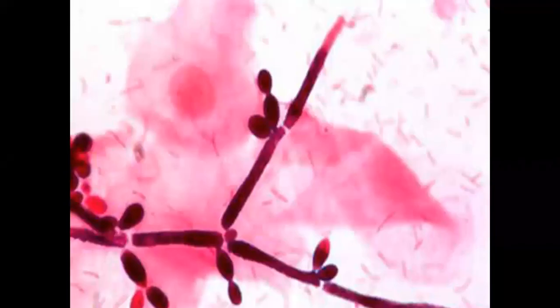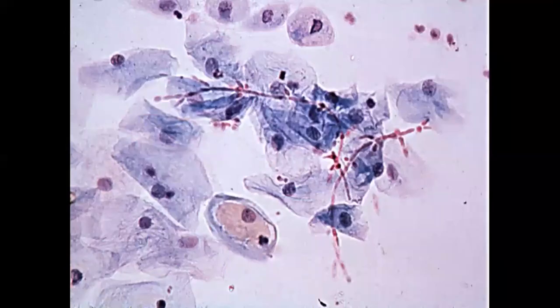cervix, you can see the fungal hyphae and the buds. This is again Candida, but this time this is sputum. You can see cells which are flat epithelial cells, and these are from the buccal cavity. You can see some of the cells on the top of the slides which are a bit rounded. These are the cells from the respiratory tract. So this is an infection from the upper respiratory tract and the mouth.